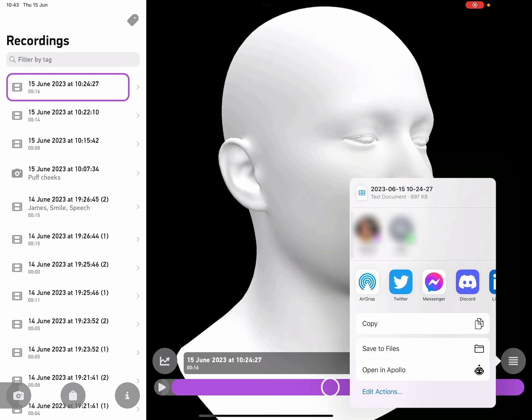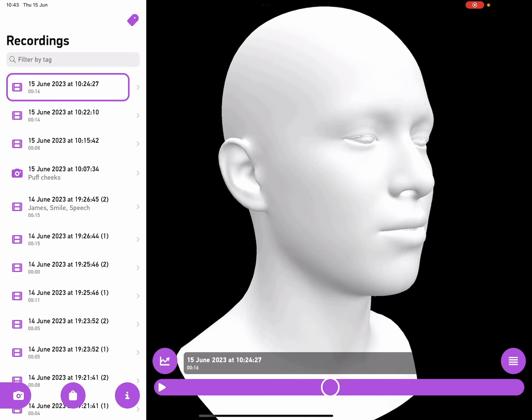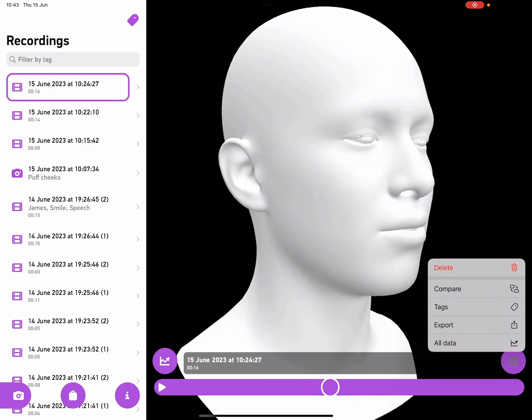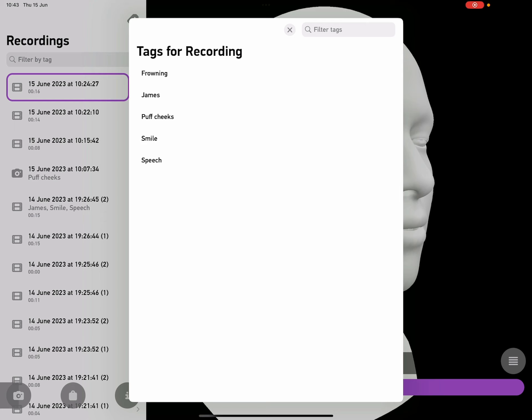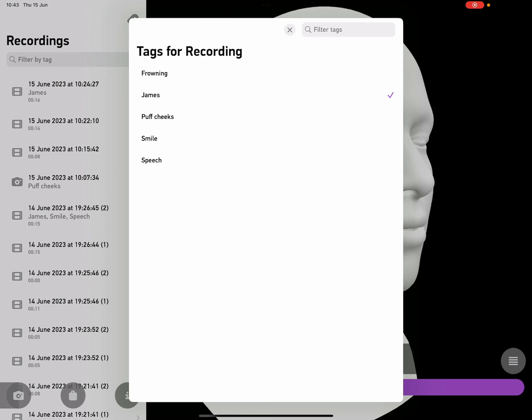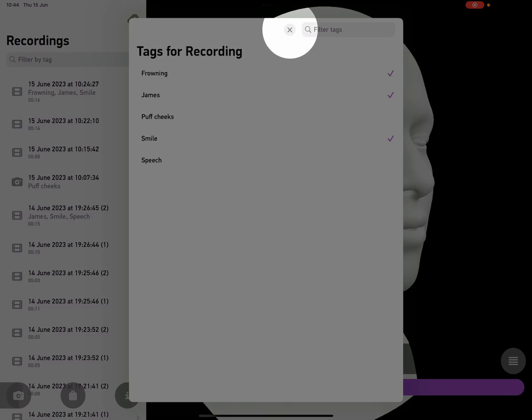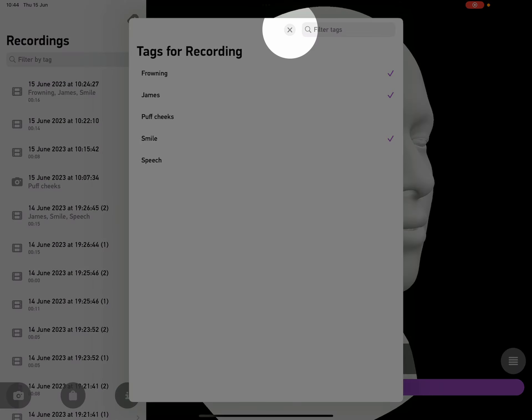Tap on the background to get rid of that menu, tap on the menu again, and this time choose tags. This brings up a new window. What I can do here is tap on these tags to tag the recording, so I know what was involved in it. Tap the cross to close that window.